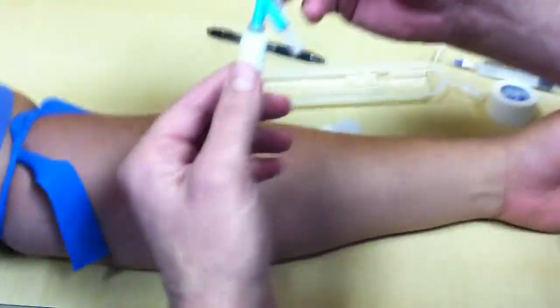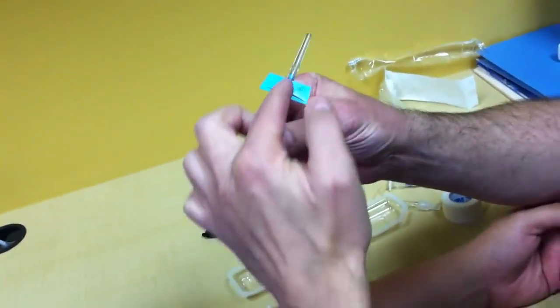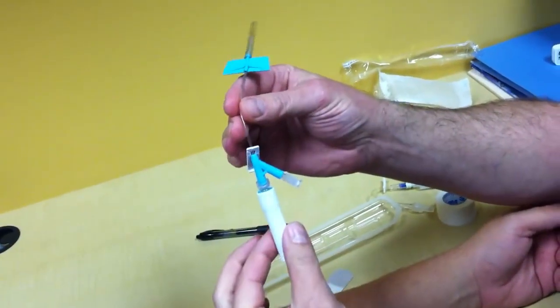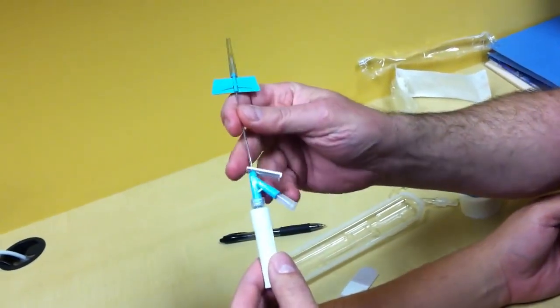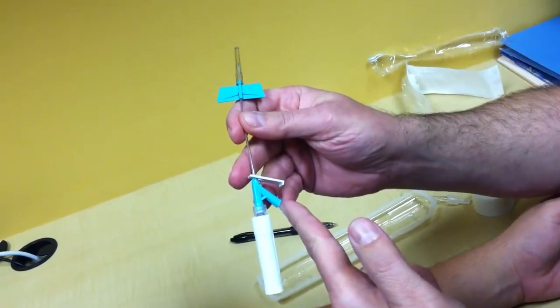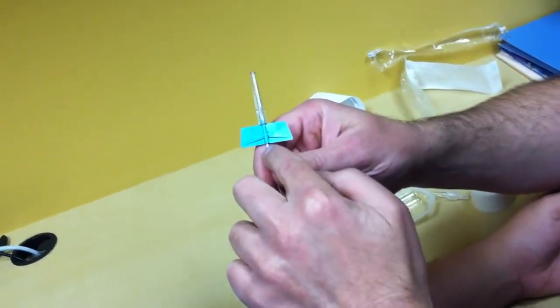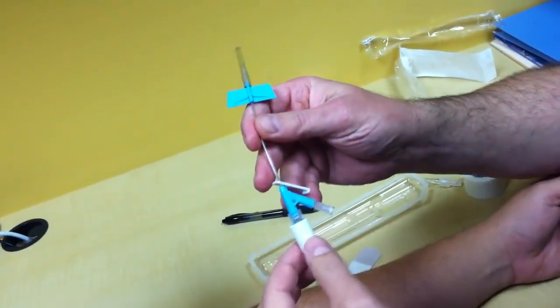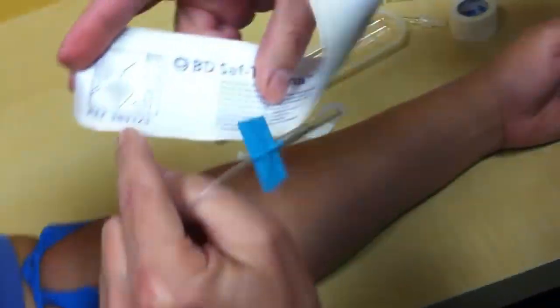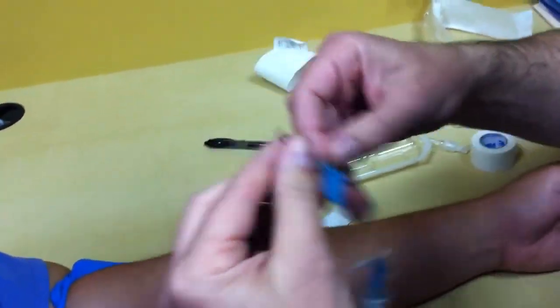This particular catheter has a needle that withdraws on a cable. The needle is in through the catheter here, attached by a cable all the way to this handle. If you get one of these, make sure you get the one that has the extra port here — if it doesn't have the extra port, you're not going to get a flash of blood when you inject. So make sure when you order, you order these. There's your reference number. These are the easiest to use, the cleanest, and the safest.